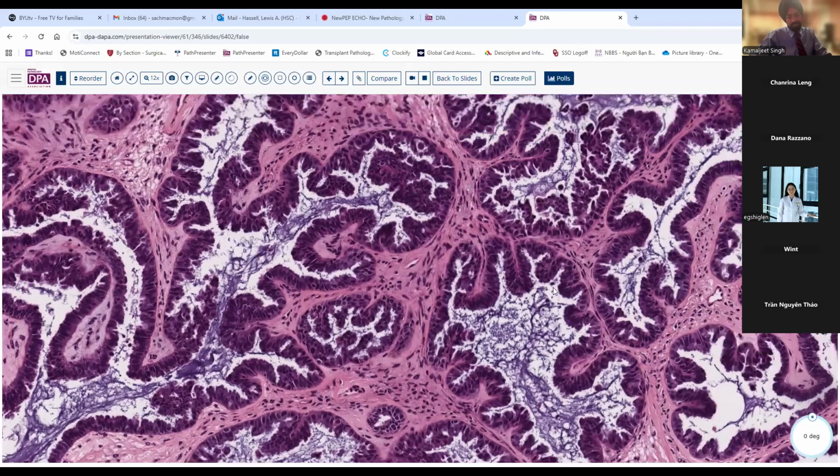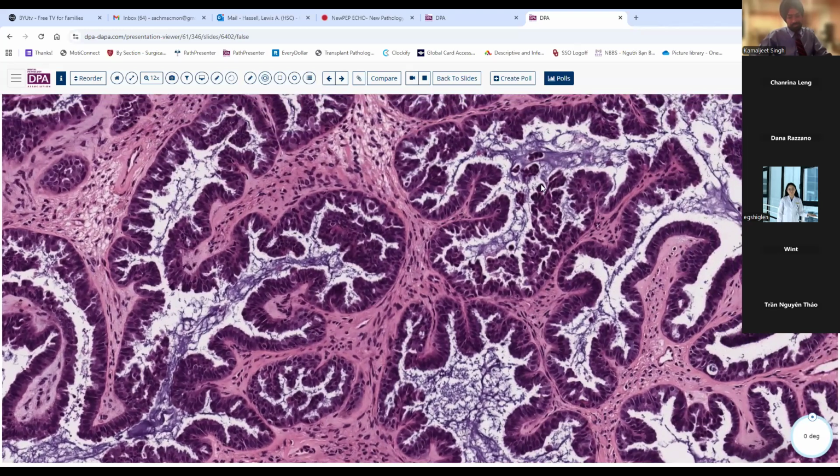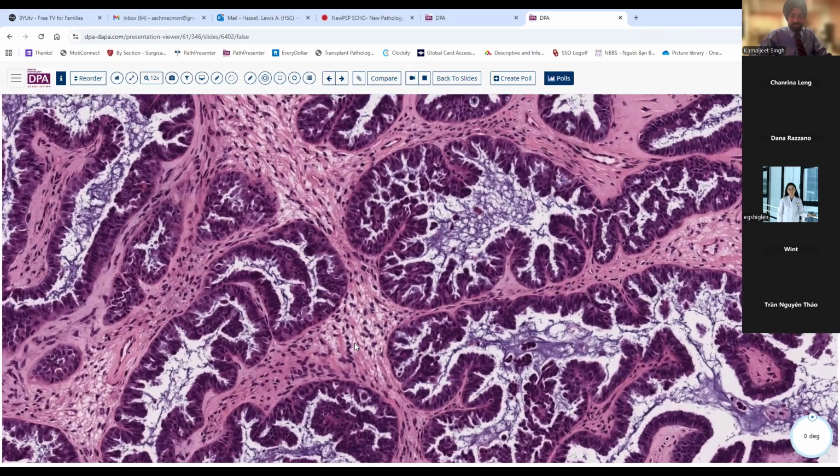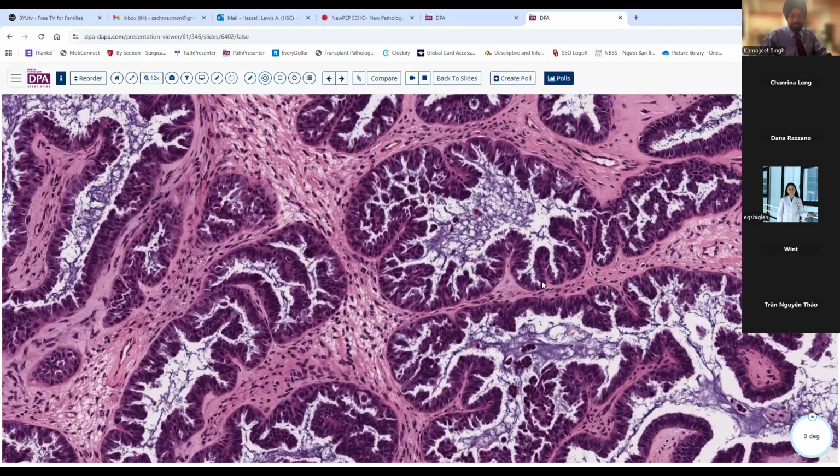And by micropapillary, we're referring to just the very small tufts and so forth. That's in contrast to the designation of micropapillae, which is generally 5 times as long as it is wide. So this probably fits into that category of a micropapillae.